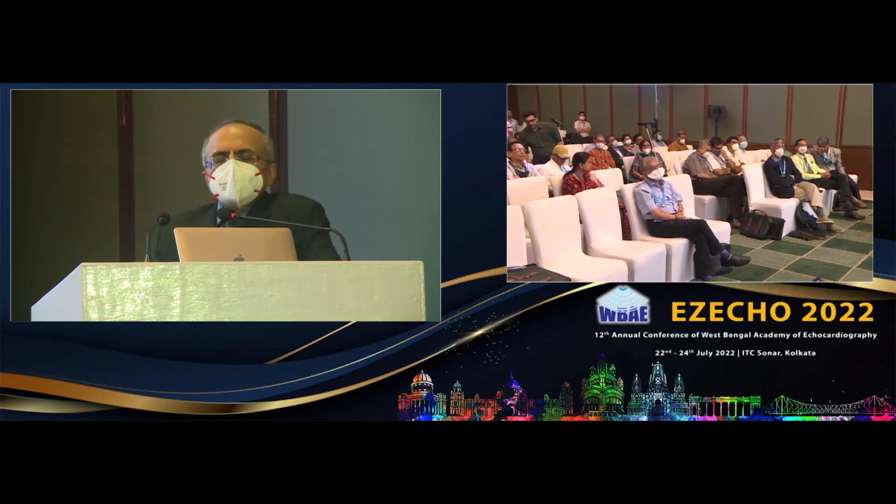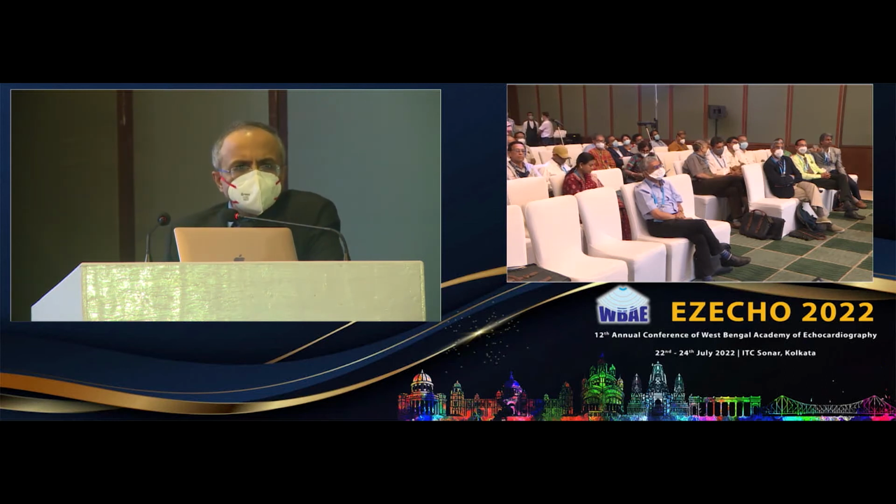Correct. So the replacement fibrosis is what you see grossly as LGE, which is irreversible in most places. If it is not a local edema or granuloma, most of the thing, which is because of apoptosis or myocyte loss, will be irreversible. And that is what you see by LGE imaging. It's a very robust imaging, with very little variability. So there is a replacement which probably will never recover.